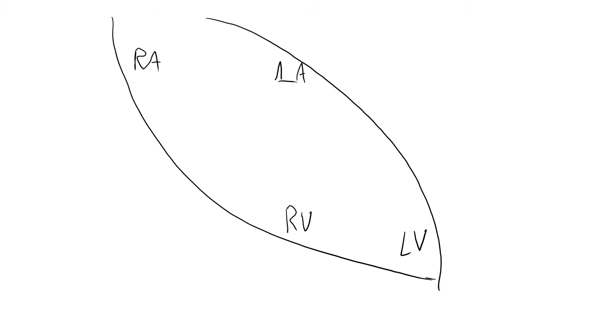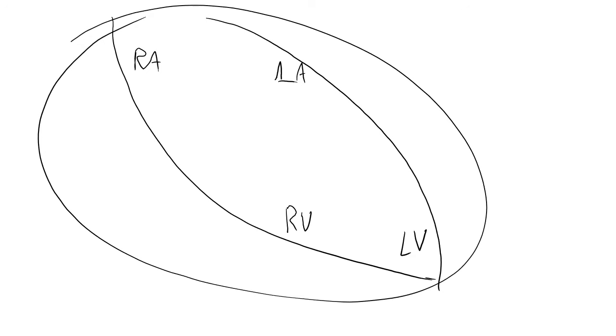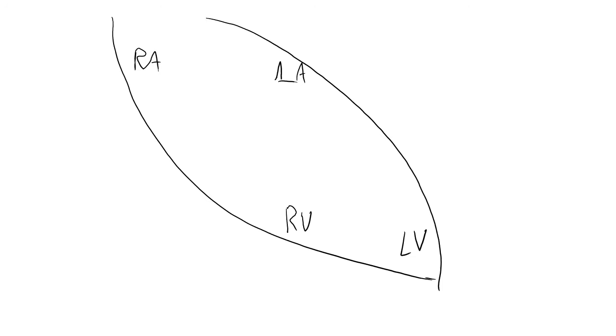So usually you'll be given a table that shows you all of the leads in terms of the ECG trace and where these leads correlate to in terms of a physical structure. But the way I like to memorize it is in terms of the actual structure of the heart. So we have the heart here, and this is pretty much what the heart looks like in the chest, because as you all know, the right side is on this side and the left side is on that side. Basically, I like to translate the ECG leads onto the physical structure of the heart.